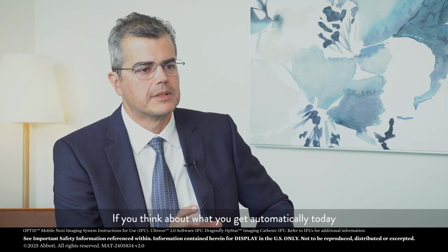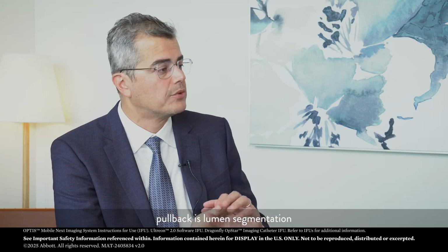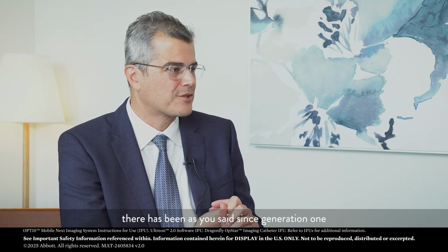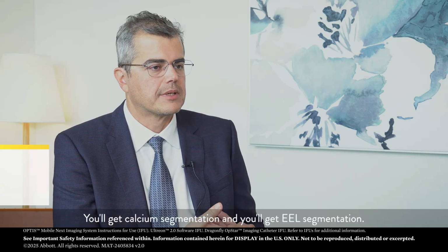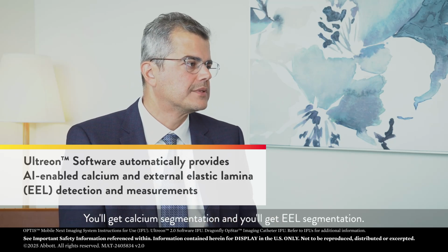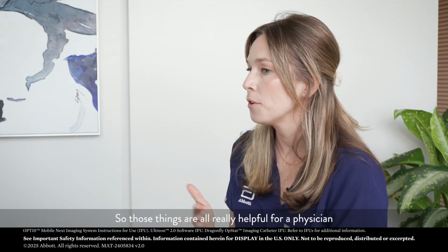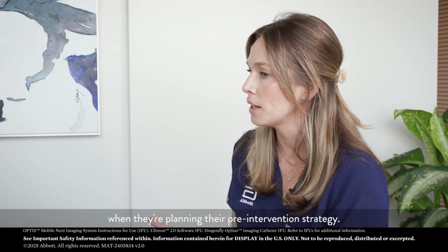If you think about what you get automatically today on the pre-stenting pullback, it is lumen segmentation, which has been there, as you said, since generation 1, but it's even better and more robust now. You get calcium segmentation and you get EEL segmentation. So those things are all really helpful for a physician when they're planning their pre-intervention strategy.